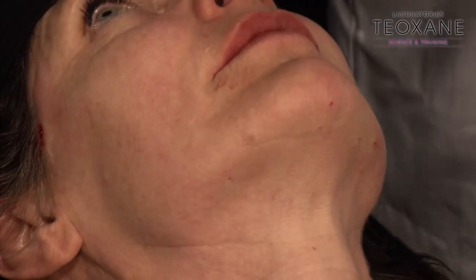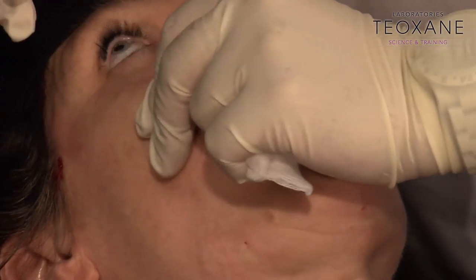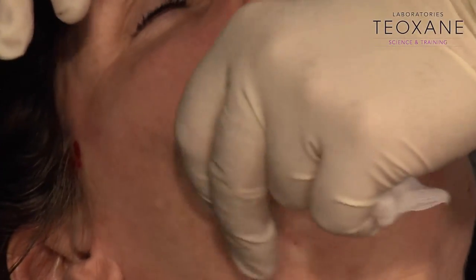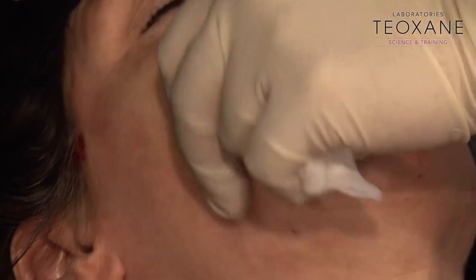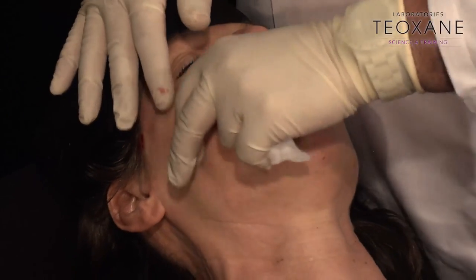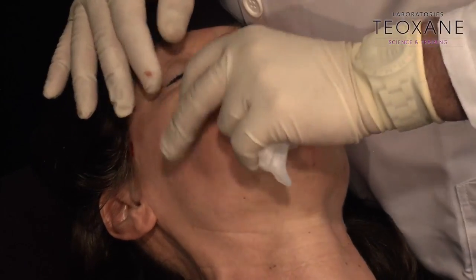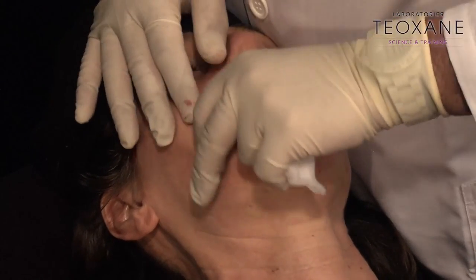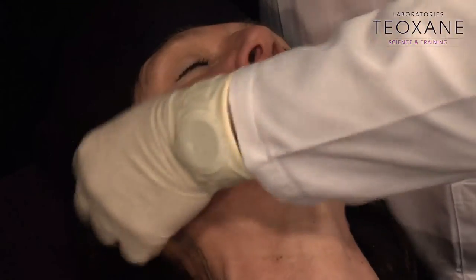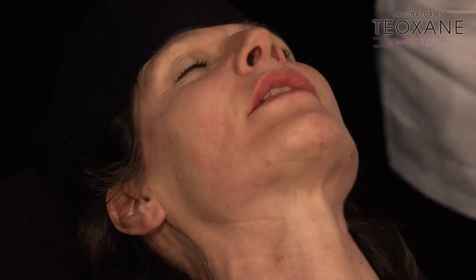Okay. Same thing. Open your mouth. I check. Am I even? If it's not the case, you spread out with your fingers. Do not hesitate to put your fingers. It's sculpting. It's not injecting. It's also sculpting. You really need to be hands-on, as we said. Put your hands on. Control what you're doing. Okay. I have to finish the chin area with a small cannula.